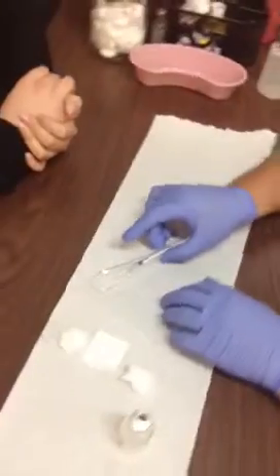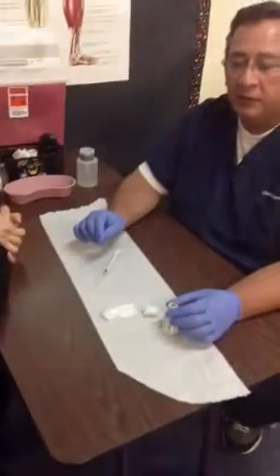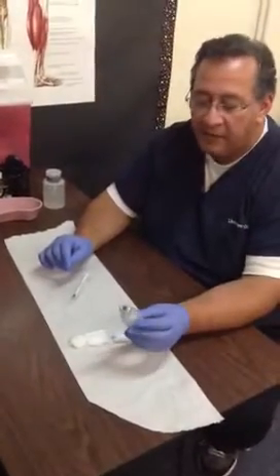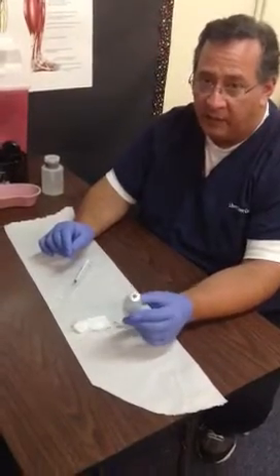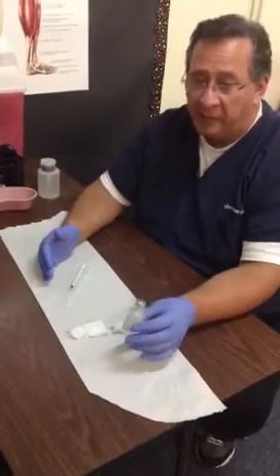I want to see you handling needles with one hand as much as possible. Now that you have your syringe prepped with medication, we're going to check our label a third time. I can see I still have the right medication. I need to see you check your label three times — it's an industry standard and we expect the same thing here.